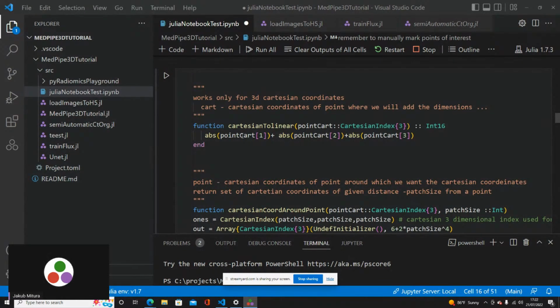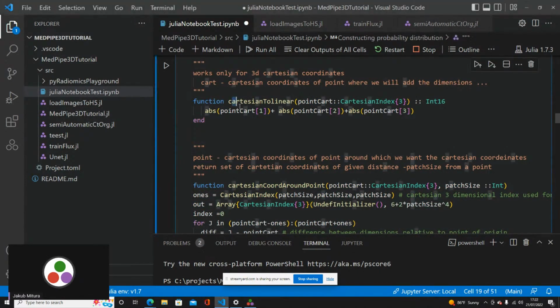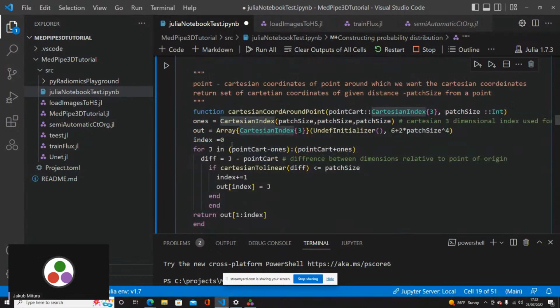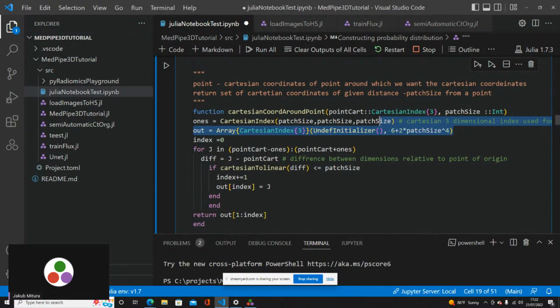So first of all, in order to get the information from around, we need to know exactly where we are. The very nice thing about Julia is that it supports Cartesian indexing, so it supports these x, y, z coordinates. We can use it in a lot of fantastic ways. One of them is that we can get the Cartesian indexes of some area and filter those that we are interested in.